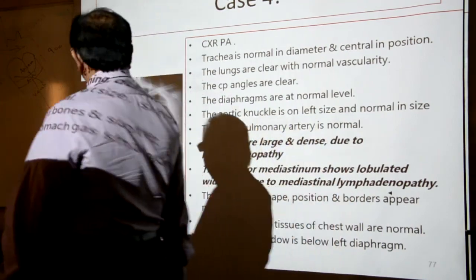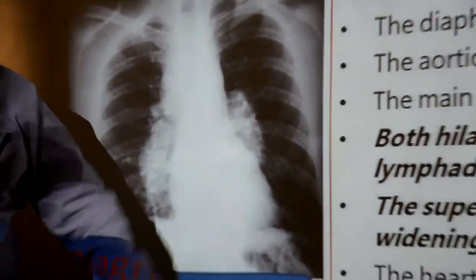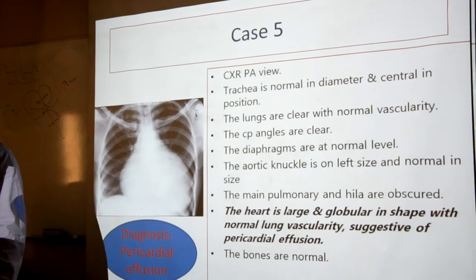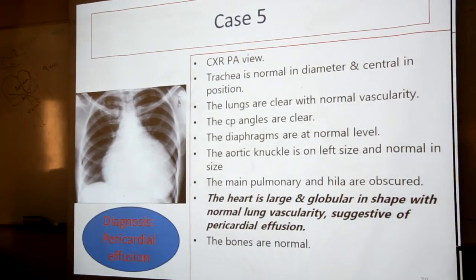Is there a deviation of the heart to the left? Do you think this is the midline? No. If I draw a midline here, one third is here, two thirds is here. Similar. Okay. Okay, who will describe this? Another volunteer, come quickly. Who is the next volunteer?